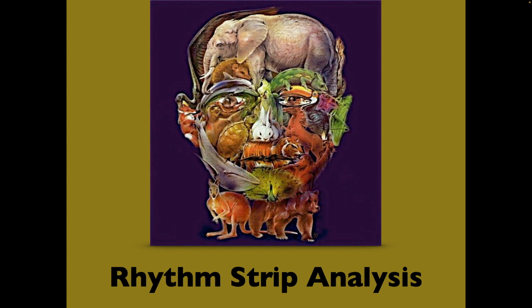So here's the P wave, PR interval, QRS, we'll just do an R and an S, T wave, okay? And usually the P wave is smaller than the T wave.